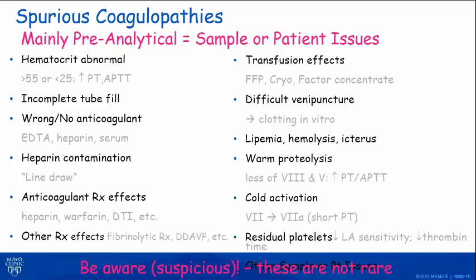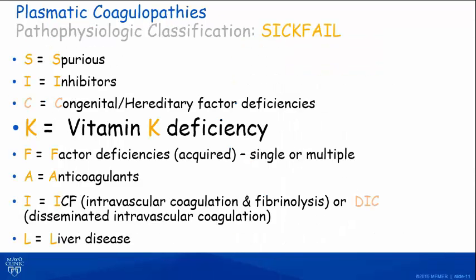And then if the sample is what we refer to as a frozen sample, we don't test fresh samples in the reference laboratory. They're centrifuged, frozen, preferably at below -40, and promptly. If this doesn't happen in good order, one can get artifactual conditions: proteolysis of the labile factors, activation inadvertently with factor 7. If the sample is not completely frozen, if you don't spin out the platelets, you reduce the lupus anticoagulant sensitivity.